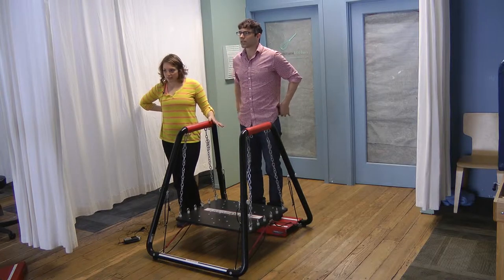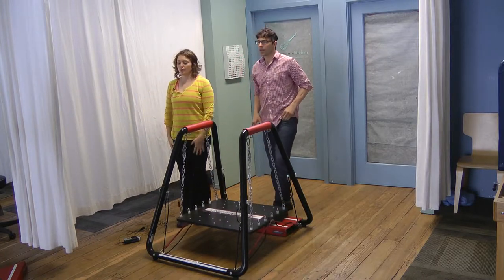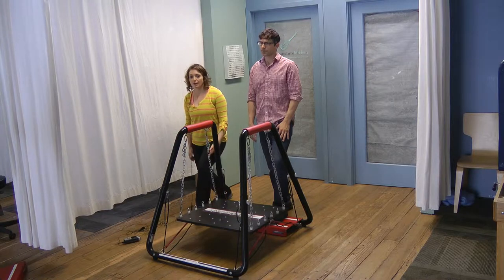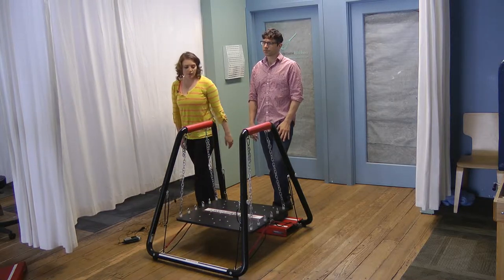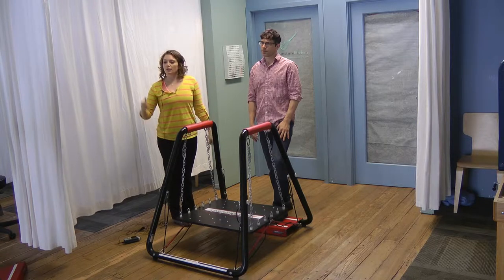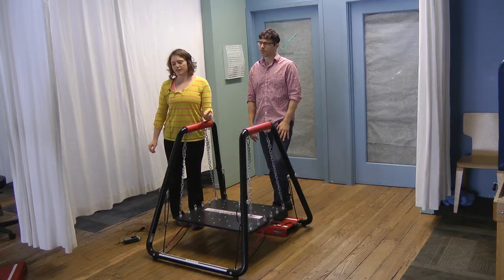We do a lot of balancing exercises on here, especially for people who are working with new joints and things like that. We can do lunges, stepping onto the platform and then stepping off to create that balance. We also do a lot of tandem standing with it sideways so it wiggles from side to side, and throw in a ball toss. You can do some statues of liberty — you can really get creative with this thing.